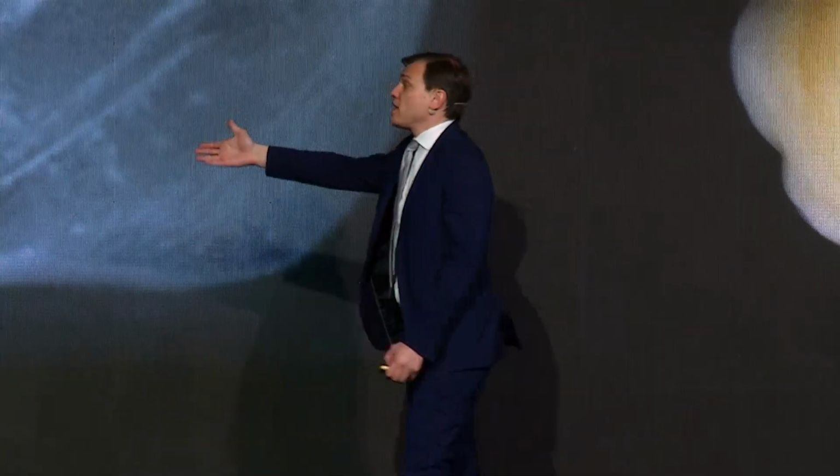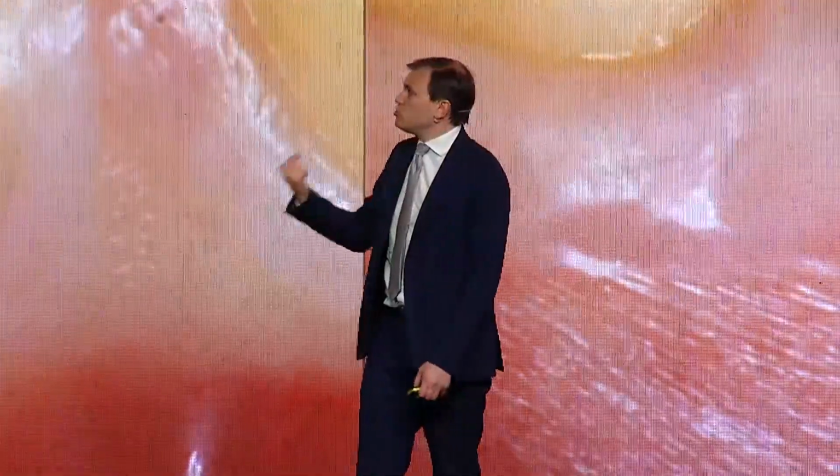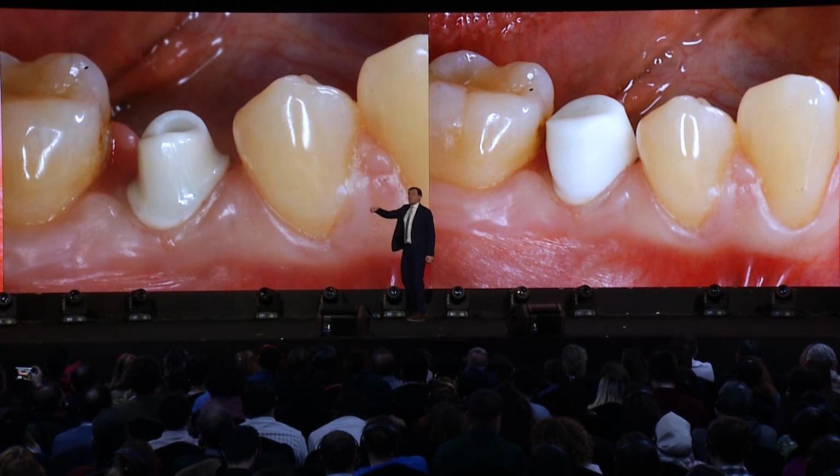Something happened and then you see that it's better than you thought. This is one of the cases when I got the result, and it taught me really to look more at zirconia as material. Very simple situation, single implant.